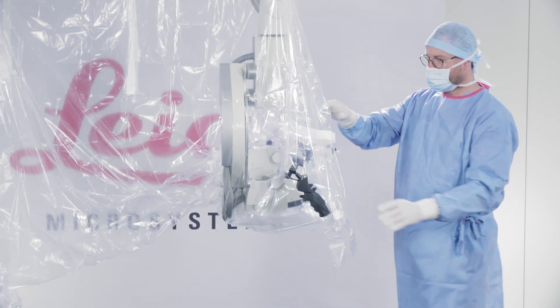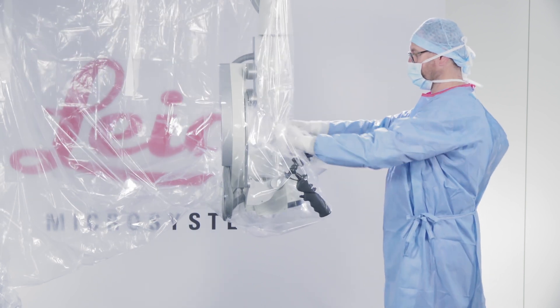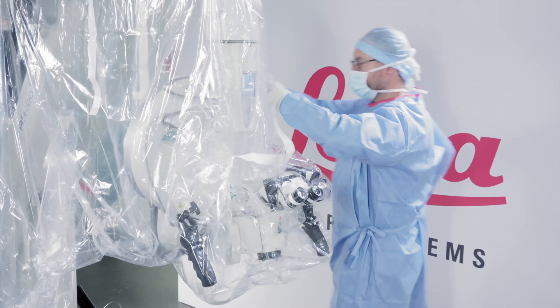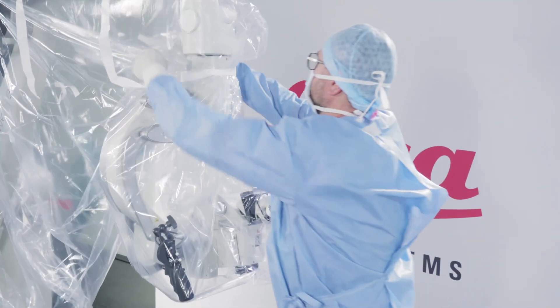Put the remaining drape inside the empty space. Make sure the drape is not covering the lens. Wrap the white straps around the head and arm of the microscope, attaching them strap to strap and not strap to drape. Make sure that the drape is fitted as tightly as possible to the microscope.